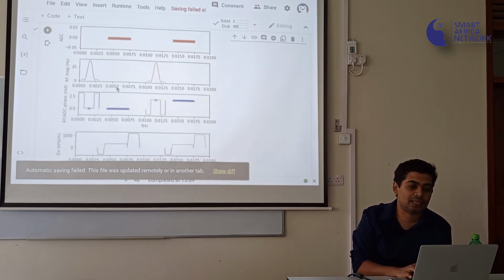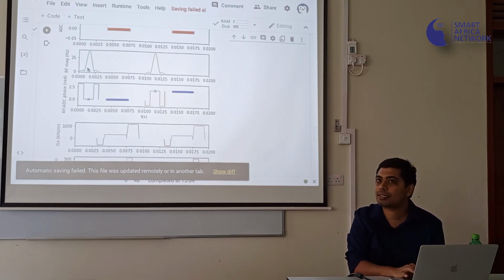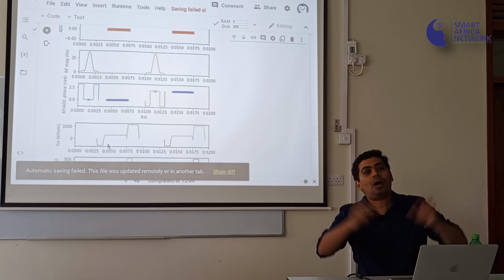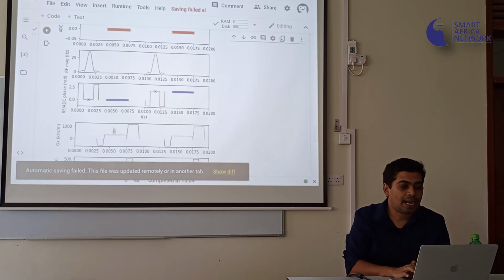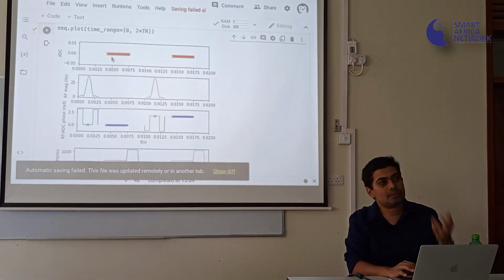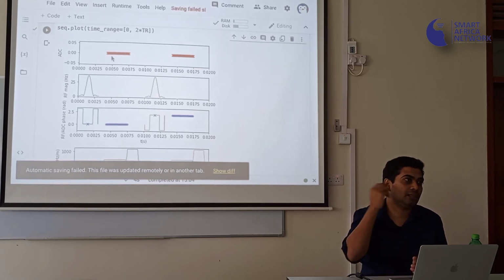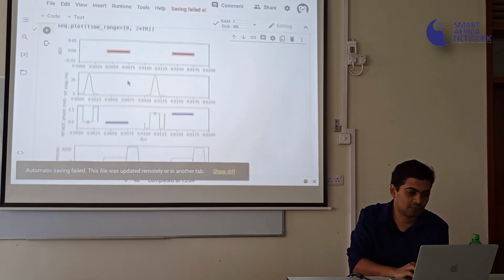Let me explain this with a simple analogy of a sonar on a ship, right? Let's say this is the sonar sending out the signal, this part, and then this part is to basically say, within that vast amount of ocean, just look at a particular place. That's what that gradient does. And after some time, you hear the echo coming back from the ocean floor. So you transmit, you do a bunch of things with the gradients, and then you hear the echo coming back through the ADC, which is the analog to digital converter.